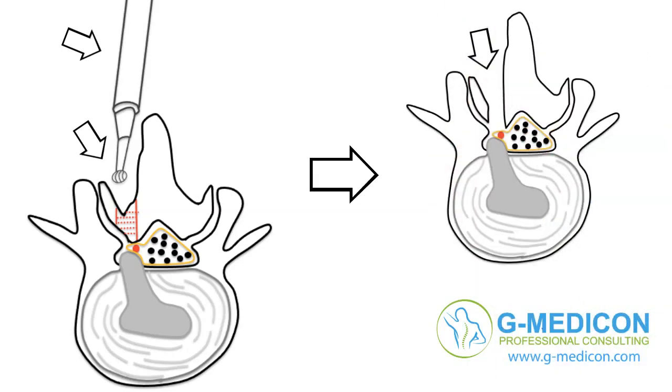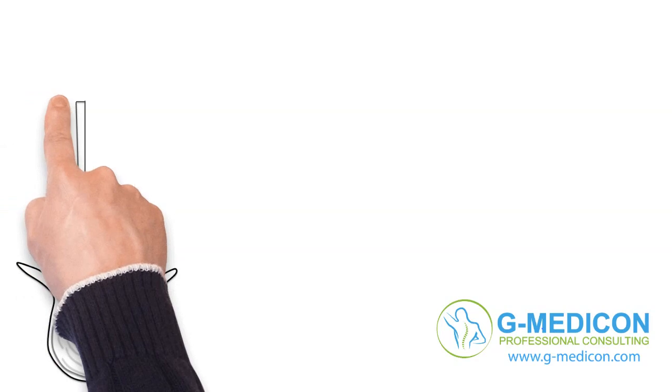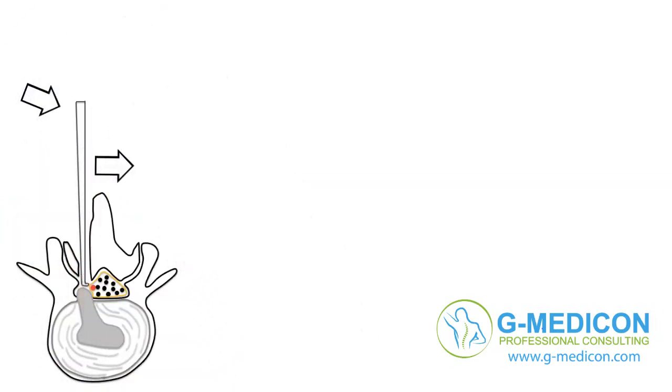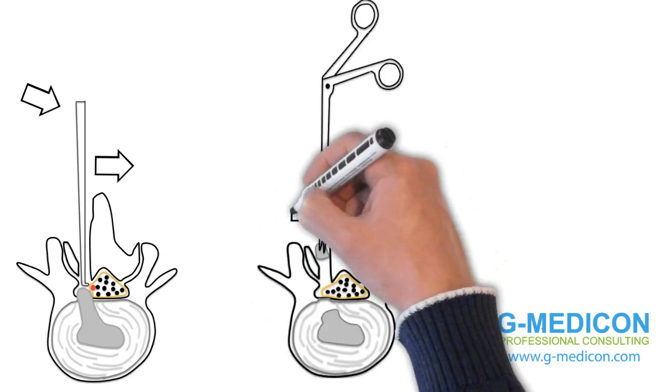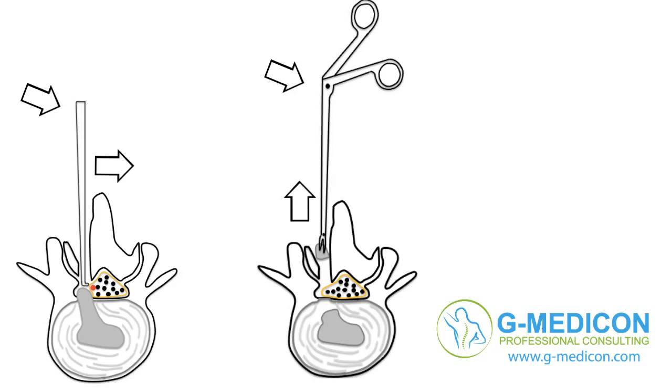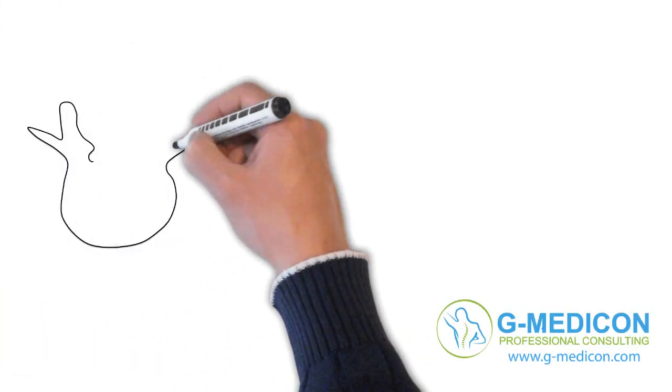The dura is mobilized with a retractor towards the center of the spinal canal to expose the herniated fragment. The herniated fragment is then removed with grasping forceps to release the nerves.